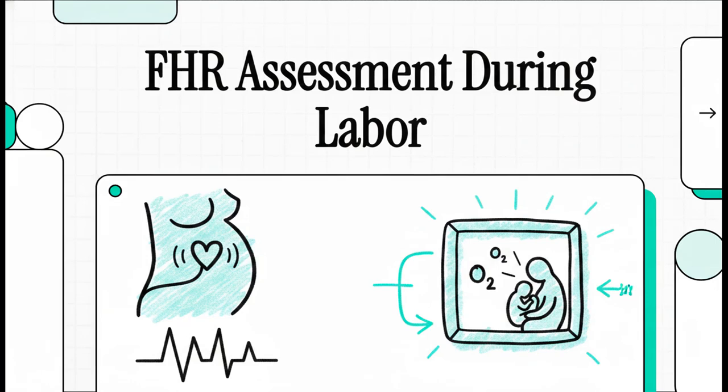All right, let's dive right into this masterclass explainer on fetal heart rate monitoring. Today, we're taking a complex, high-stakes clinical skill and turning it into a logical framework that's absolutely going to guarantee your clinical readiness. As a labor and delivery nurse, monitoring the fetal heart rate is, hands down, one of your most critical responsibilities. And why is that? Well, because these patterns are a direct window into fetal oxygenation and well-being. Catching abnormal patterns early? That drastically improves outcomes for both mom and baby.